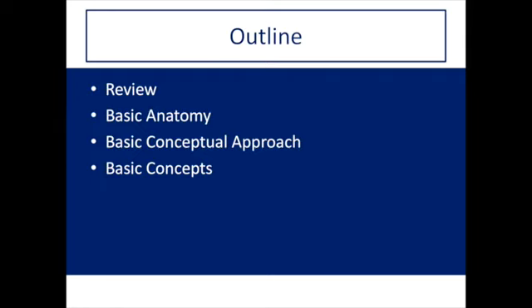Next, we will discuss windowing. Windowing is of utmost importance when looking at CT heads. It's very easy to miss key findings if you don't window appropriately. After that, we will learn by repetition. We will go through multiple cases with our approach and directly apply the things that we just learned.